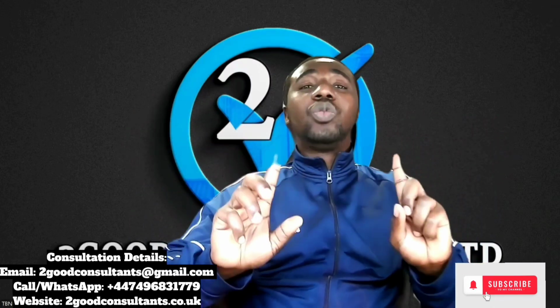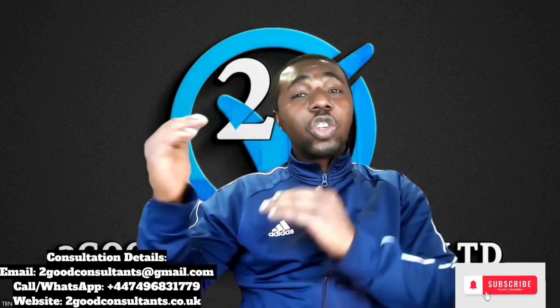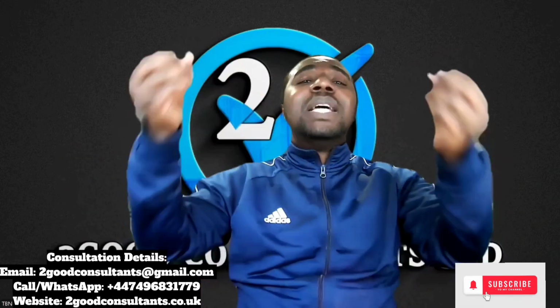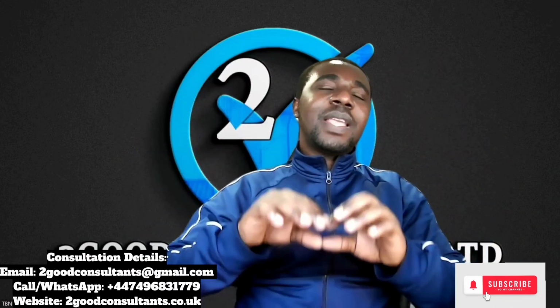So I'm going to be talking to us about something that could also contribute to poor IHC staining. What is it? Inadequate deparaffinization.